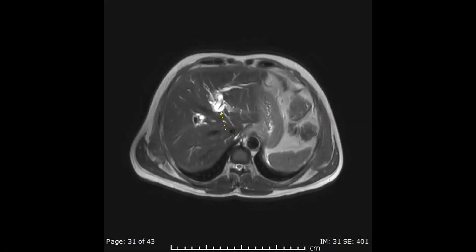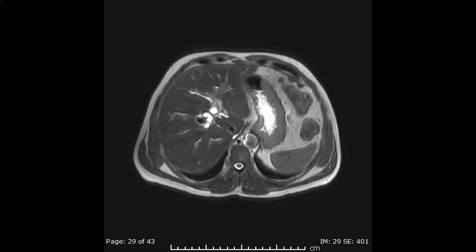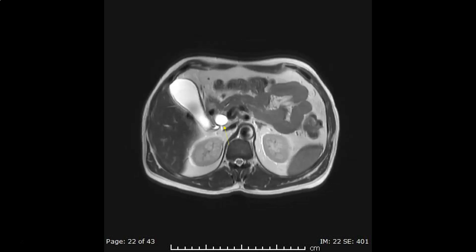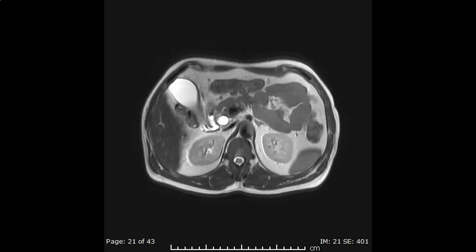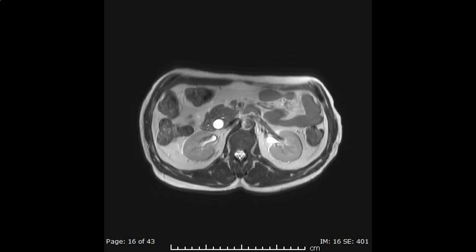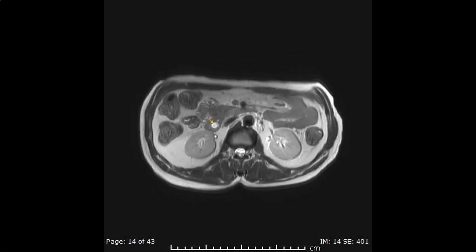The transverse T2-weighted images show dilatation of the intrahepatic bile ducts, dilatation of the common bile duct, and normal caliber of the pancreatic duct. And at the lowermost end of the common bile duct, we see something — we don't know if this is a stone, a tumor, or sludge.